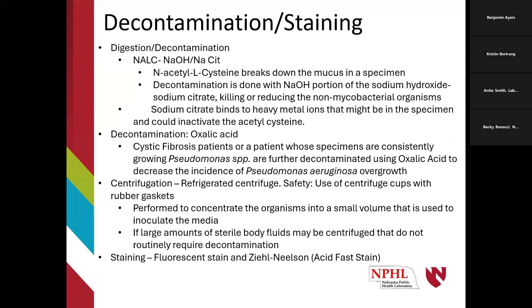Another type of decontamination is oxalic acid. We do this after the sodium hydroxide portion. This helps in patients having a high Pseudomonas overload in their cultures, such as cystic fibrosis patients, and this process decreases the incidence of Pseudomonas.